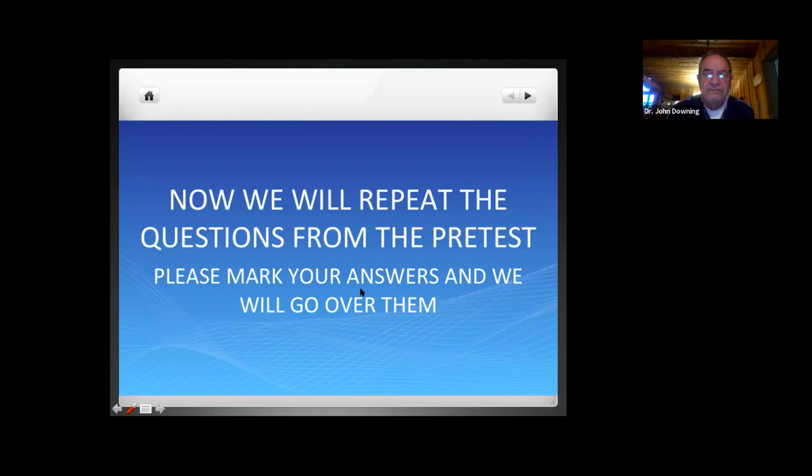Number 4. When would you not want to do hydrodissection? If there are loose zonules, not really. If there's a posterior polar cataract, there it's very important not to do hydrodissection. You want to do just hydrodelineation, work from the center out. Very soft cataracts, it's important to do hydrodissection. Those are the ones that are often hardest to get good hydrodissection on, and it's important. And you did very well on that.